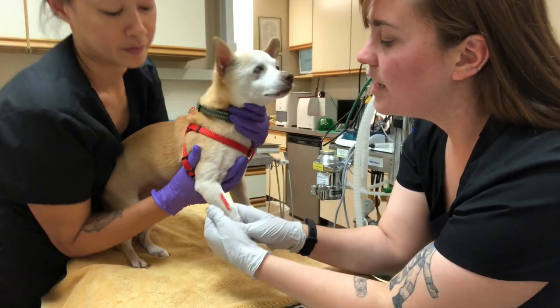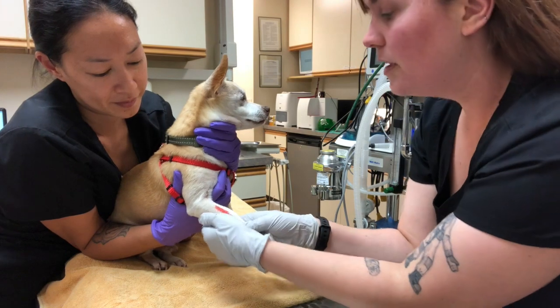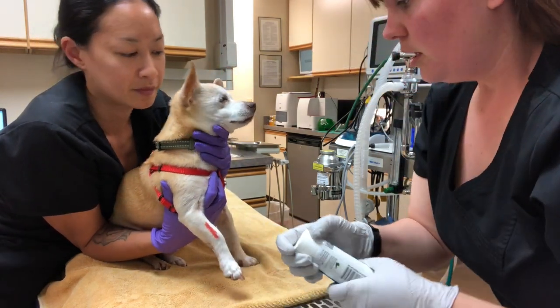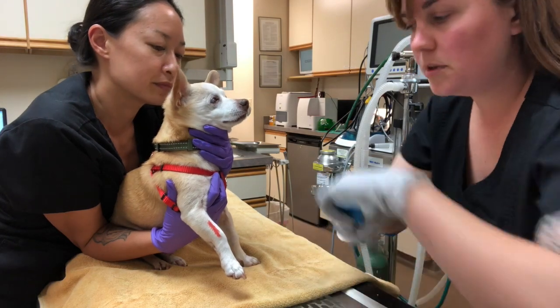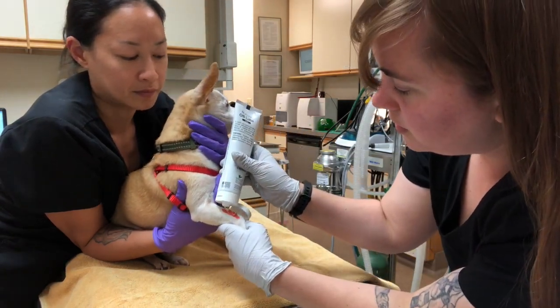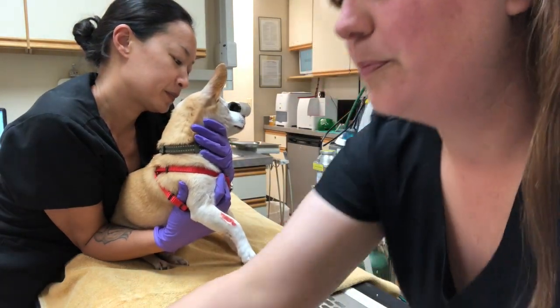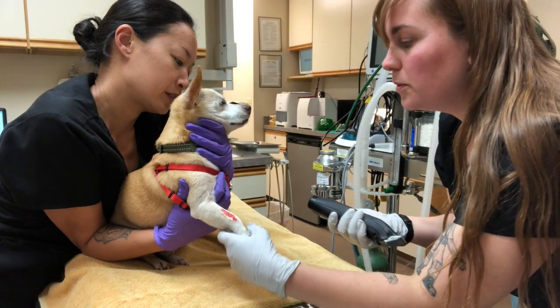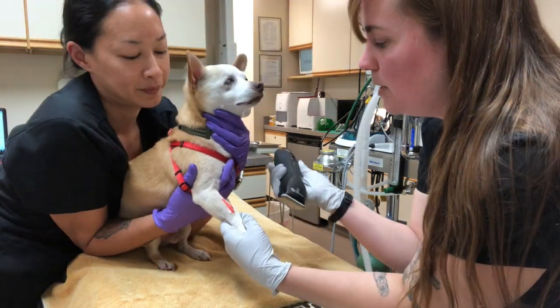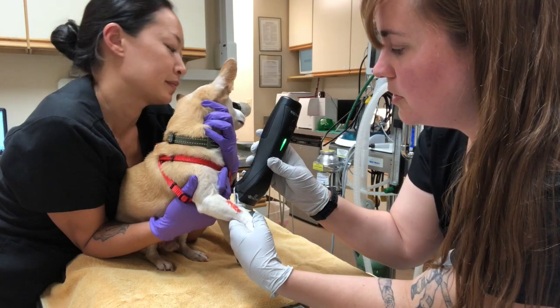So I'm going to apply a temporary laceration bandage to Turtle here. We have a fake laceration made on his arm with marker. So pretending that it is an actual wound, I'm going to start with some sterile lube. It's just been opened. I'm going to place it on the wound to prevent any debris or excess material falling into our wound. That way I can clip around it so that when I clip, it can fall onto the lube instead of into my wound.